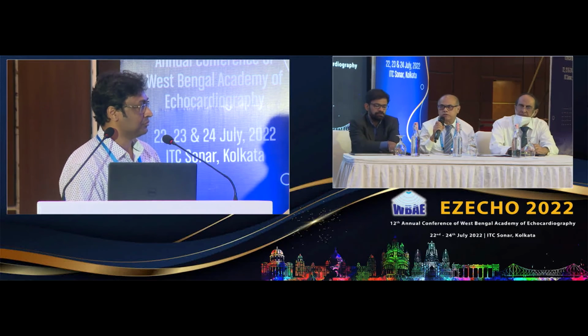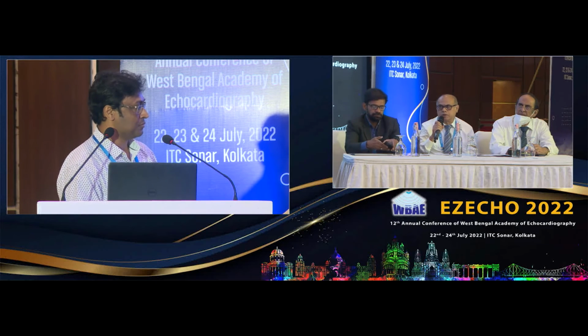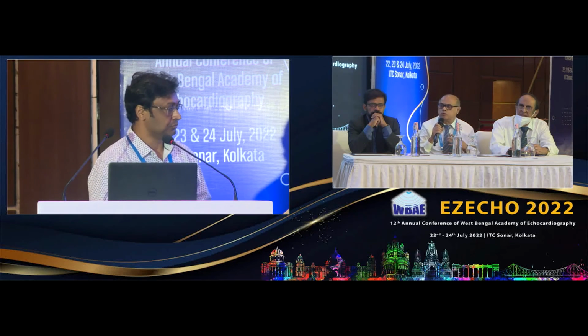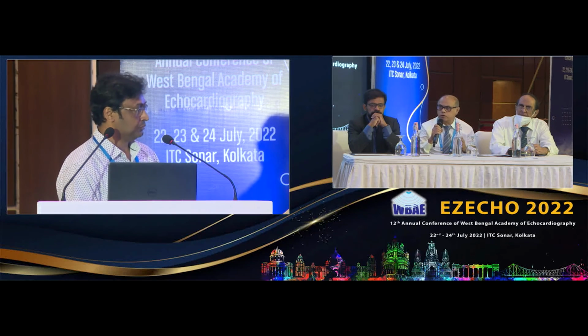Particularly, anesthetists tell the surgeon after coming off bypass how the valves are moving, and what the gradient is. Though lots of inotropes are going on at that time, so the gradient may be to some extent fallacious, it still gives us an idea.